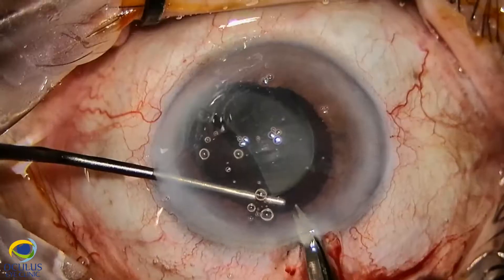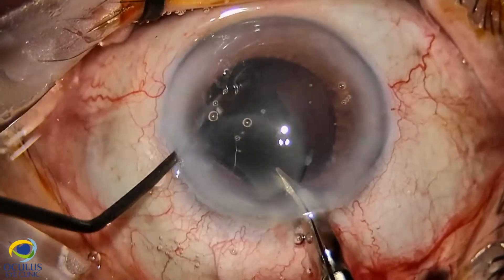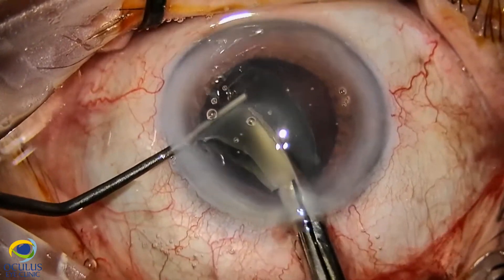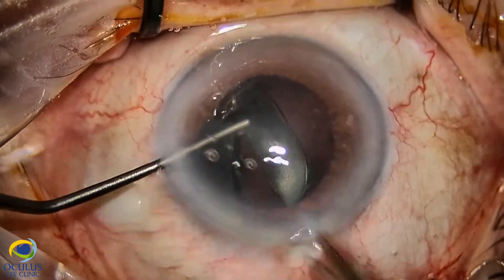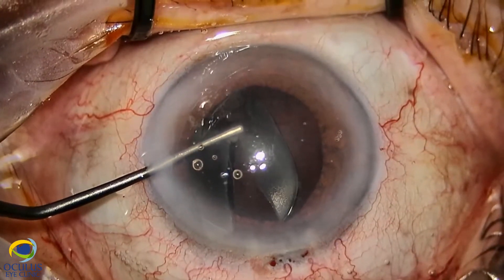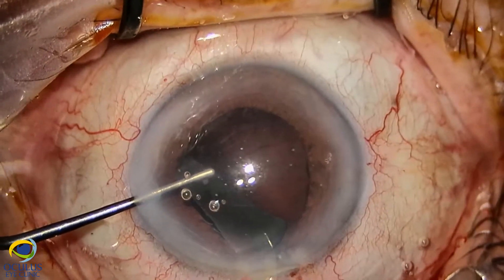And now we cut into pieces the remaining two thirds of the IOL, paying attention not to lose these smaller pieces, because the danger of having fallen pieces in the vitreous is quite significant. As you will see, the break in the posterior capsule is quite large.